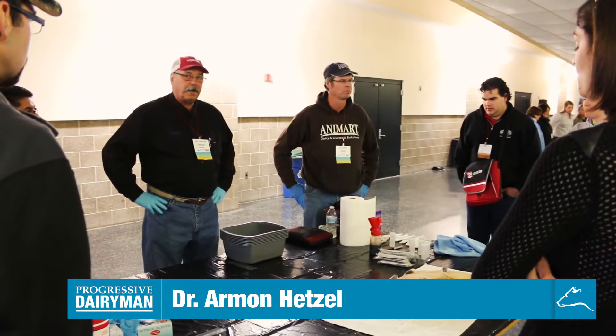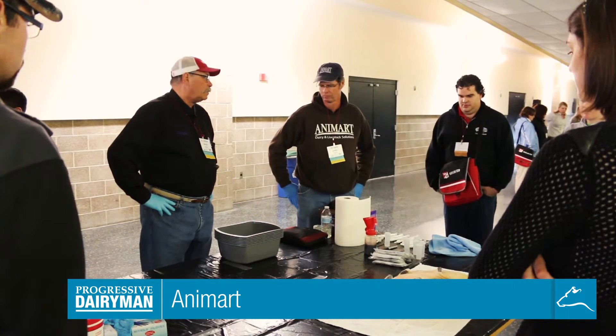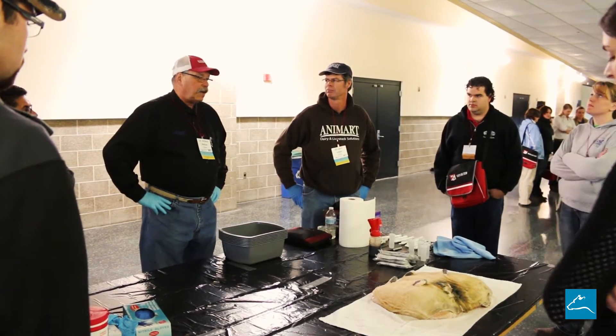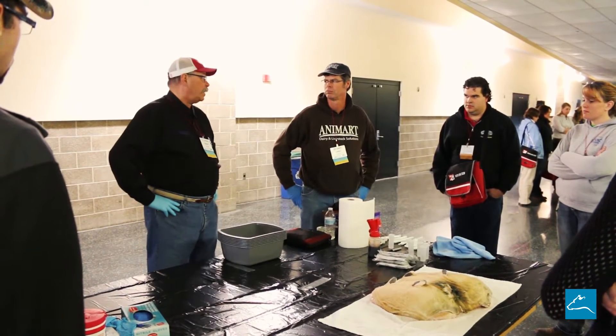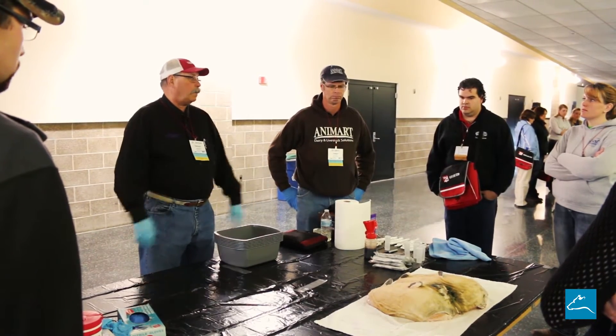What we're going to do is demonstrate how to give a proper culture — make sure we get true, honest results when we're sampling cows. With the latest PCR testing diagnostics, which is really, really sensitive, we want to make sure our udders are clean and dry before we take our samples, so our samples are as pure as we can get for proper results.